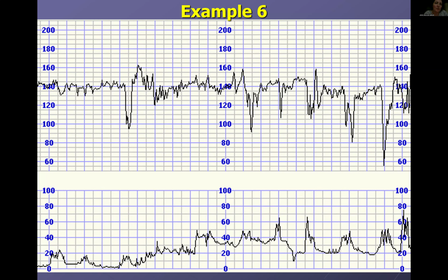Very often when you have a trace, you are monitoring the patient. Because if it's looking non-reassuring, you're monitoring her and assessing at least every hour. And if you started off with the baseline being, let's say, 140 at 10 a.m., and now at 11 a.m. it's 120 to 130 consistently, you make note of that, because it is significant.